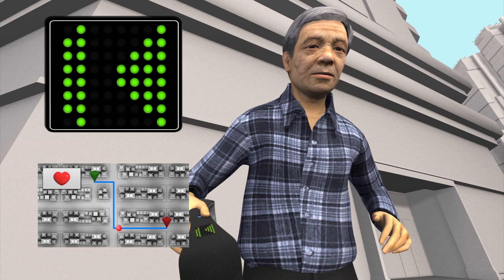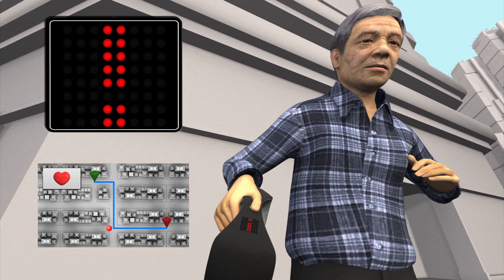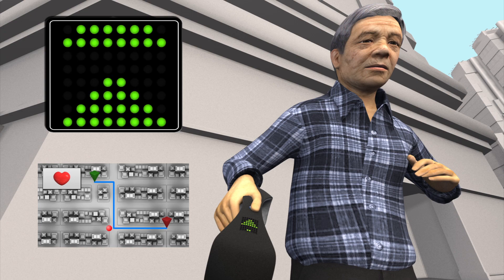If the user wanders off course, the handle vibrates and the LED screen points them in the correct direction.